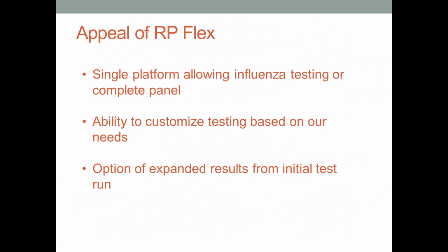So at the time we were making this decision, our hospital was in an extended process of being sold. So the slide I showed you of my lab, you probably noticed that some of those instruments haven't been purchased recently. So we are still doing biochemical identification of organisms. Right now we're still using BACTEC 9000 series blood culture instruments, which will actually be replaced within the next month. But because we hadn't really upgraded instrumentation in a while, we knew that we were in a situation where we weren't likely to get multiple platforms approved for purchase. And so we'd need to be as flexible and efficient as we could.